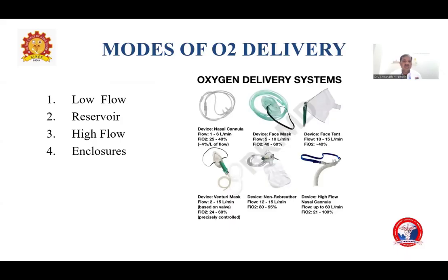Modes of oxygen delivery. Oxygen is delivered by various equipment. It can be low flow device, low flow with reservoir, high flow with enclosures.